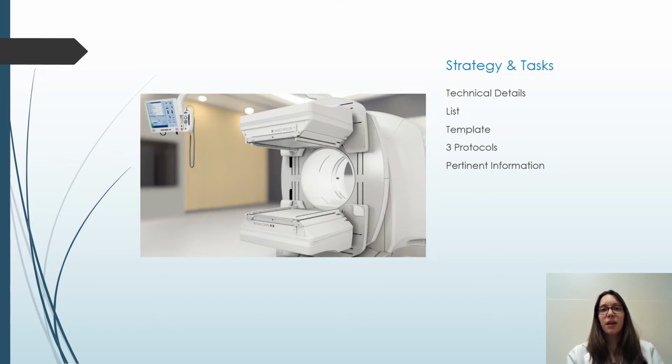I used Inland Imaging's existing protocols as a base for my protocols because we use the same radiologist, so they're going to want similar guidelines. However, they have different equipment and different setup and workflow and multiple technologists versus just having one, like here. So I made sure that my protocols were specific to the Polyclinic.